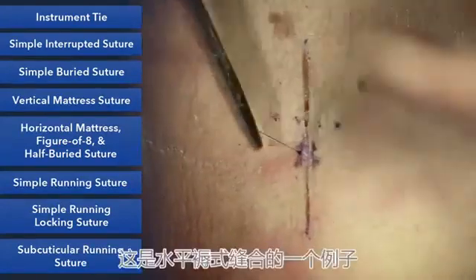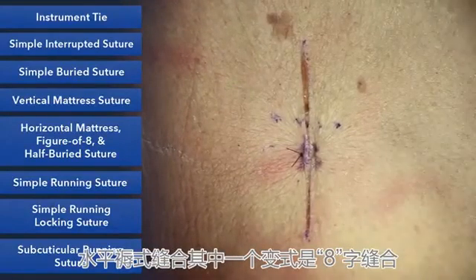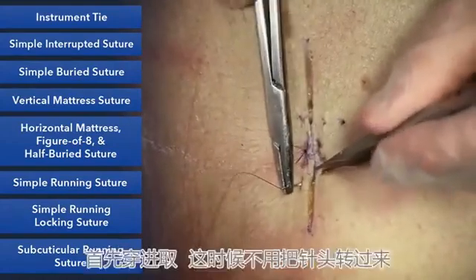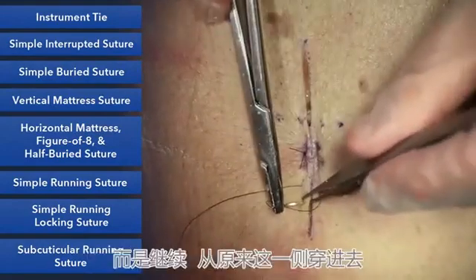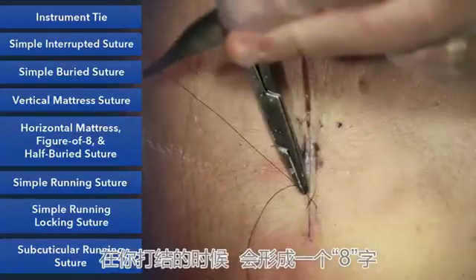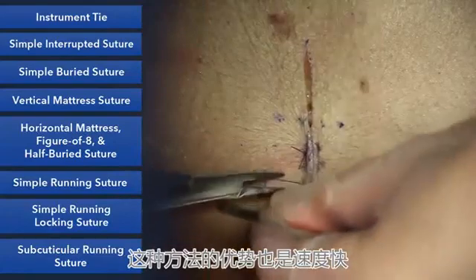So that's one example of a horizontal technique. A variant of this is the figure of 8 suture. The figure of 8 suture is the same distribution. You take your simple bite and your simple bite, but rather than turning the needle around, you move on and take your next simple bite and simple bite. What that does, when you tie this, it'll make a small little 8, and that's why it's called a figure of 8 suture. The advantage of this again is speed.